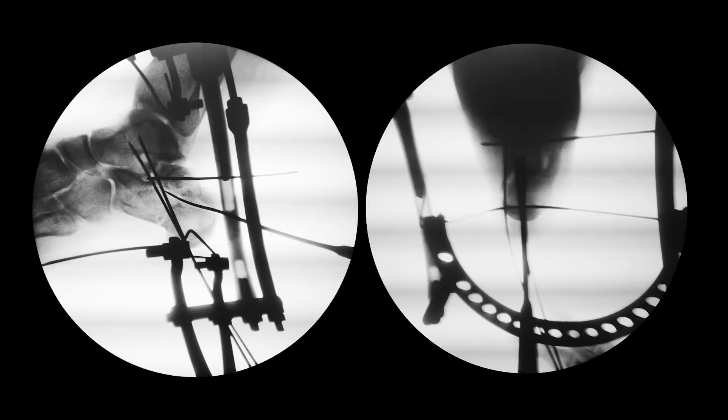Then I installed two wires for temporary fixation of the fragments — one from the calcaneal tuber transarticularly into the talus, and the second in the frontal plane from the lateral articular fragment to the medial one.